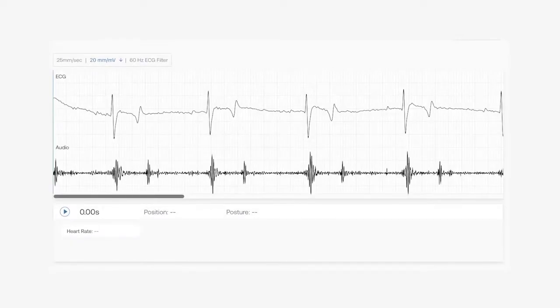What we have here is one of the printouts from that recording stethoscope. What's really neat about the recording stethoscope is that some of them actually give us the ECG along with the audio waveform and the audio recording. That's great for teaching, and also great for us as clinicians because we can see the murmurs and localize them in time with the electrical current going through the heart.